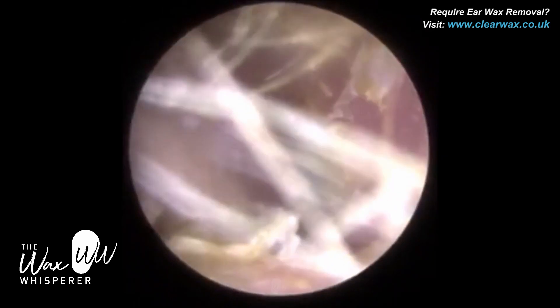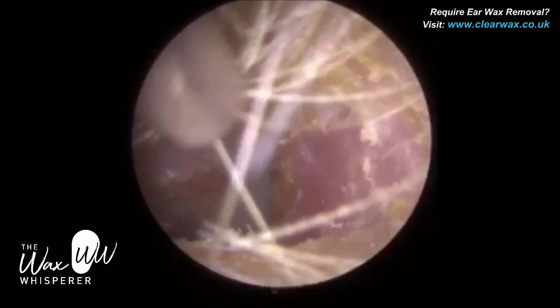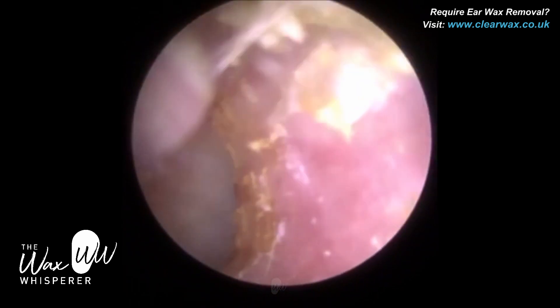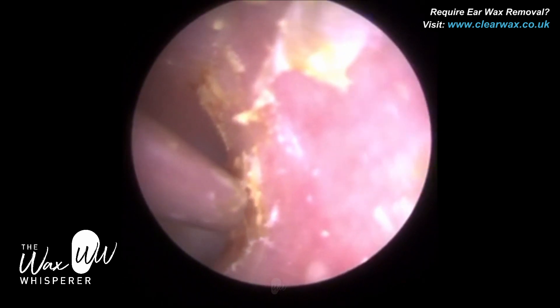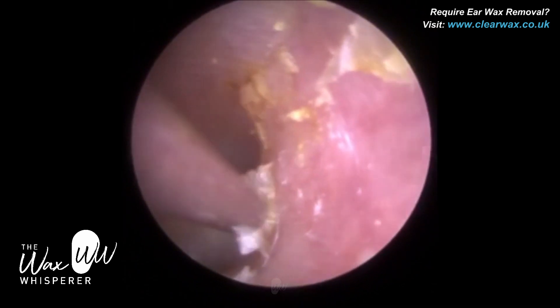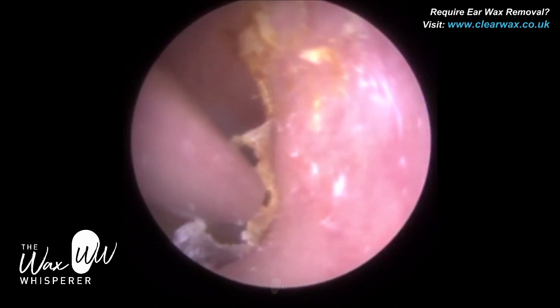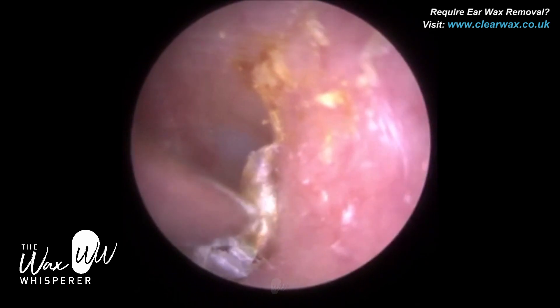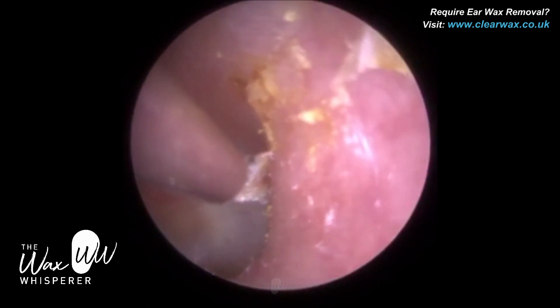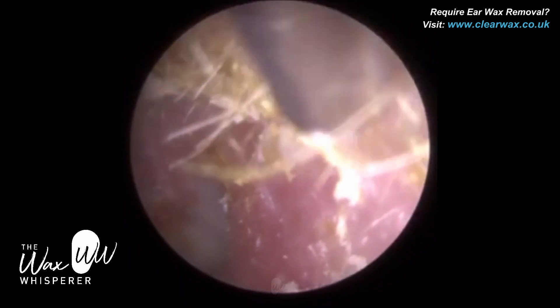I'm just going to try and remove this layer of dead skin as much as I can anyway. I've just attached a fine end and we're quite lateral at the moment near the entrance and the posterior canal wall. Now I'm going quite medial against the bony part, just trying to hover over. You can see I've managed to peel a bit of dead skin — this layer of skin I'm going to detach and extract and remove. We're never going to get every single last bit of dead skin in a case like this, and by attempting to do so you're going to cause more trauma for the patient — you're going to lacerate and cut into this very thin layer of skin that coats the bony part of the ear canal.